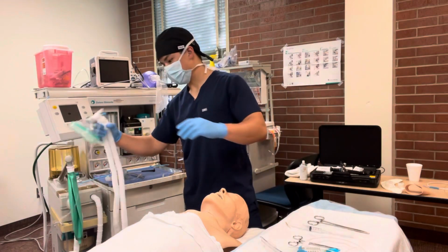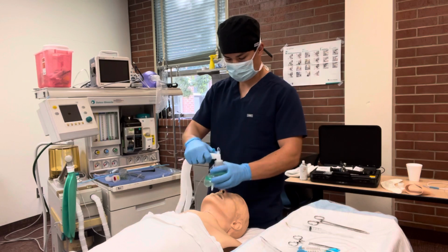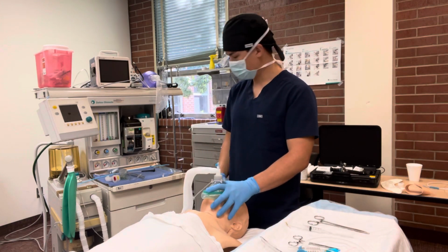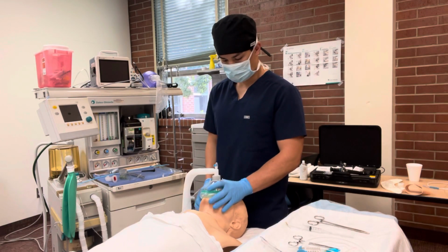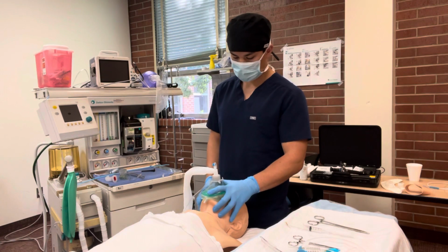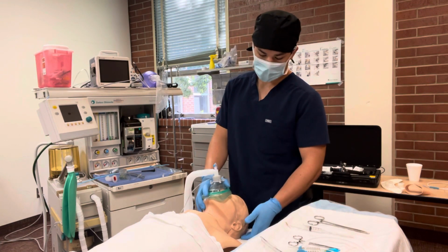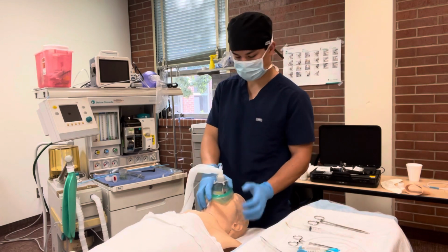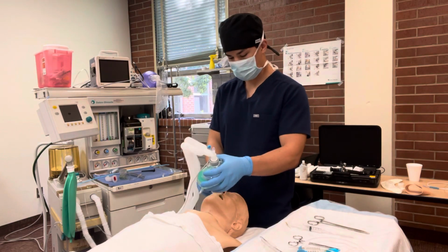So if I go to mask ventilate my patient, but I can't, I'm going to put in an OPA. If that doesn't work, I can do a chin lift, jaw thrust, two-handed mask ventilation with an assistant. I can ramp them up or put them in a sniffing position. I'll call for help if none of those work, and I'm going to move on to an LMA.